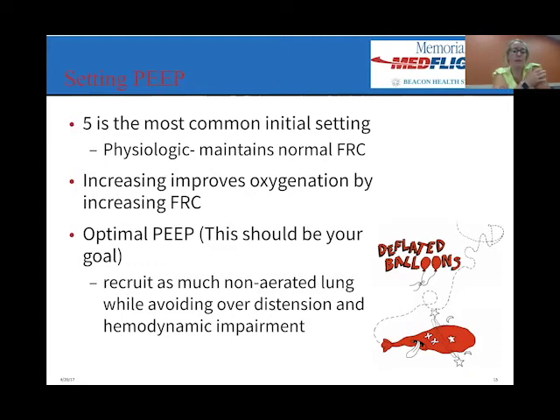They've got to open those alveoli back up and allow the oxygen exchange to happen. And so sometimes if we're switching somebody from one vent to another, and it's somebody who's pretty sick and you don't want to lose that PEEP, you can clamp off the ET tube while you do the exchange real quick so that you can keep those alveoli open and don't have to start over recruiting all over again.